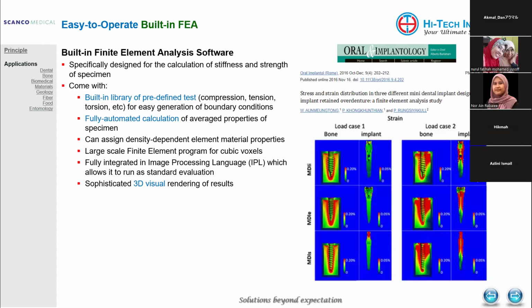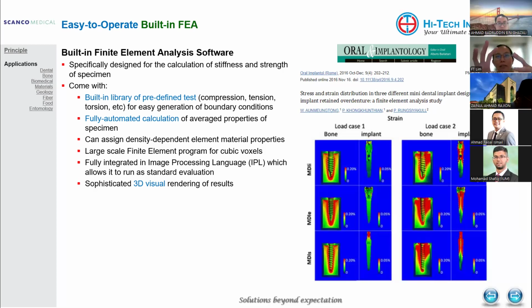And the resolution for this clinical MicroCT, the best it can go down to is 24 micron. That's the best resolution. I'm not sure, but in CT scan, the higher the resolution, the better the acquisition; you can see more minute structures. But here in MicroCT, the resolution is lower? From my understanding, is it low compared to CT?